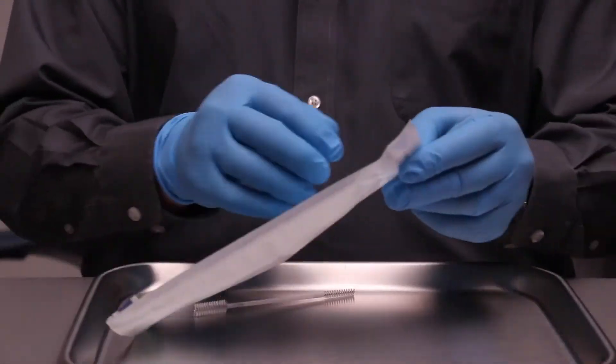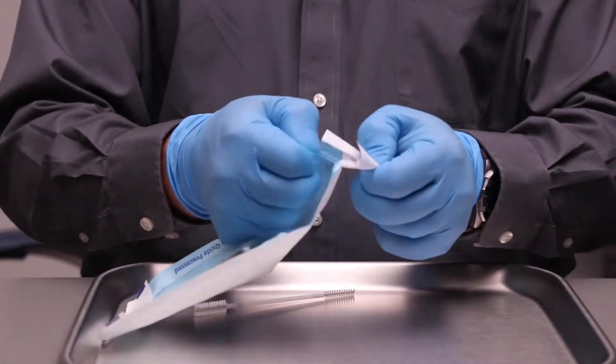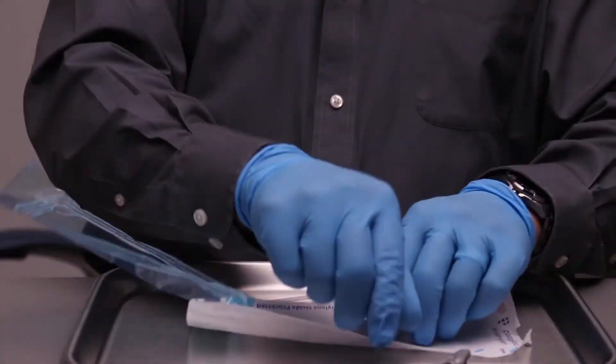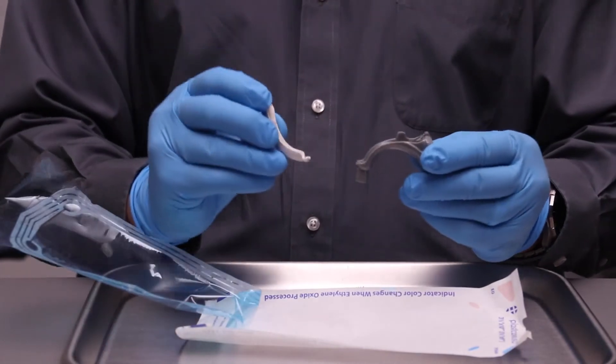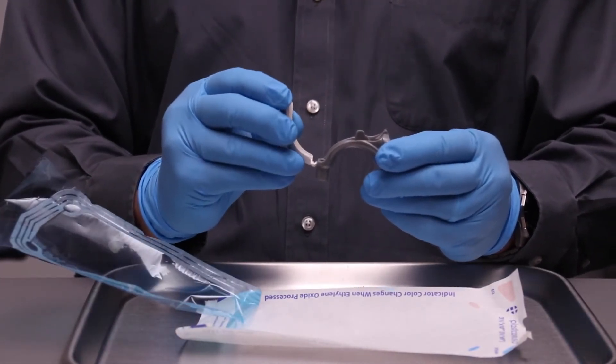Take it out of the autoclave bag and holding the bottom of the adapter, take the upper half, hook it onto the base, align it, and then press it down and click.